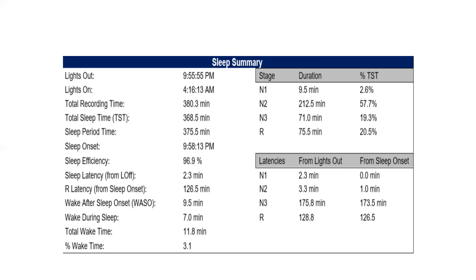Different kinds of polysomnographic machines have different templates for report presentation, but every PSG machine will present data including lights out, lights on, TRT, total sleep time, sleep efficiency, WASO, and the like.